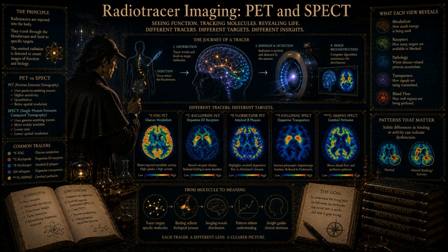But wait, if the atom is just shooting out one single photon in a completely random direction, the whole mathematical trick of the PET scanner falls apart. You can't use coincidence detection. You can't draw a straight line between 2 points if you only have 1 point hitting the detector wall. So how does the scanner have any idea where that photon came from?